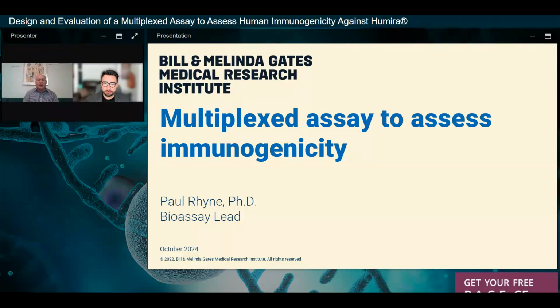So if you subject these samples to repeated freeze thaw cycles for your screening, your confirmation, your titer, neutralization, and then you want to go on to do multiple isotypes, what you want to do is to use different aliquots of that sample so you can minimize that. But even with that, antibodies are usually pretty hardy. So stability is still something that you have to show, but I would say it would probably extend well past 1 year on average.